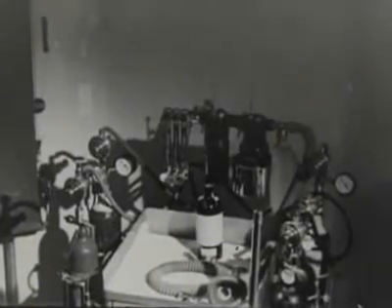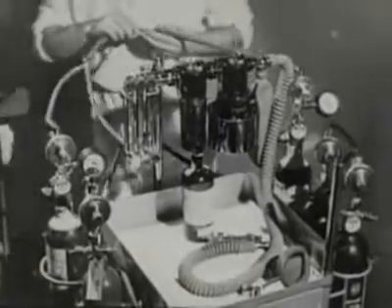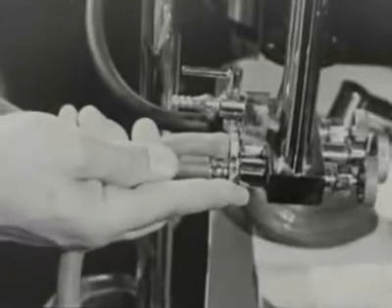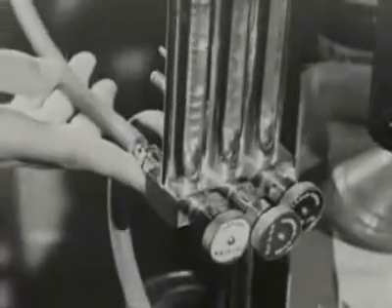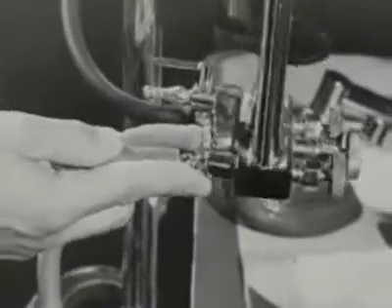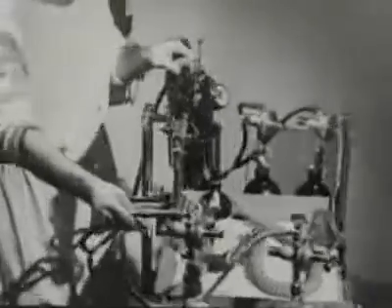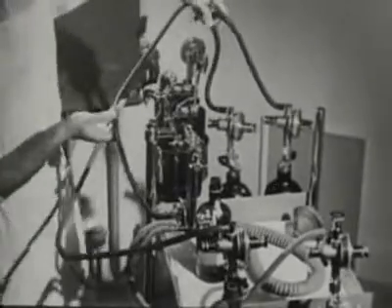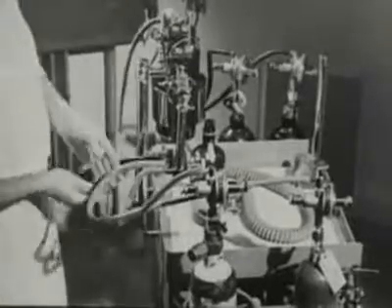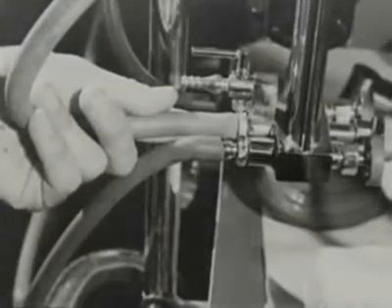Before you start to give the anesthetic, you must check the whole apparatus. First, see that the cylinders are connected to the right flow meters. This is the oxygen lead. Follow it up to the oxygen meter. This lead is usually of white rubber. Now do the same with the nitrous oxide. The nitrous oxide lead is black. And again the same with the carbon dioxide. This lead is green.